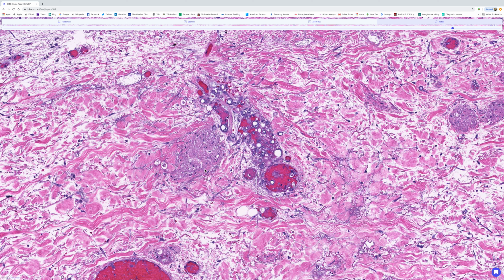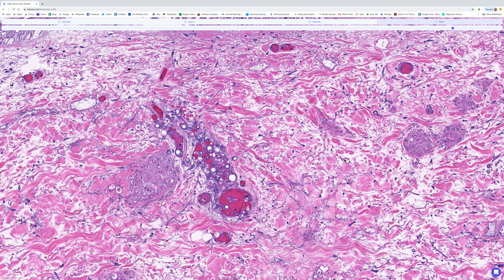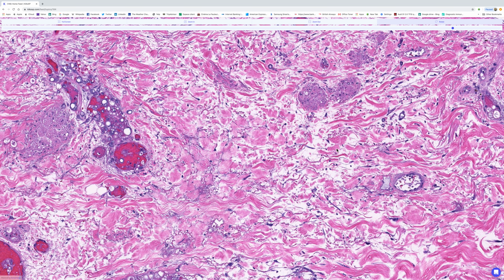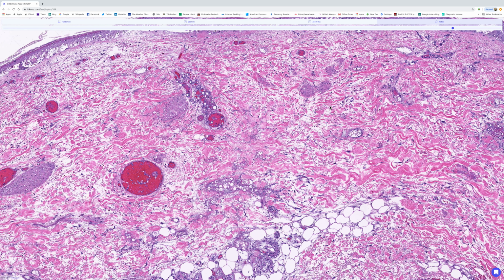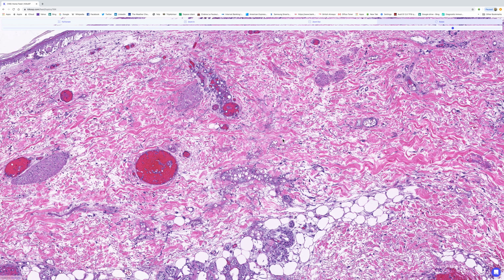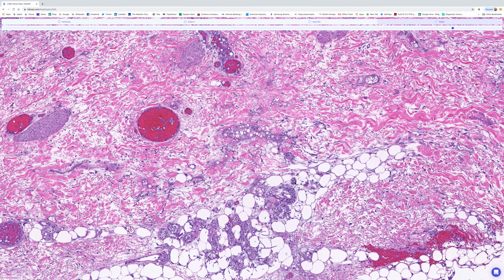Now, I've seen quite a few Aspergillosis cases, and I've never seen this degree of sporulation. So it certainly wouldn't be my first thought. But having said that, I think it's a mug's game trying to identify a species of fungus on the basis of the H&E, and I think it's much wiser to wait until you see what the culture is. And sometimes you may need even to do PCR to identify which particular species has infected the patient.